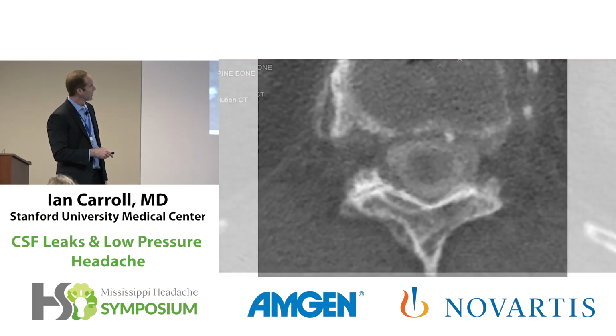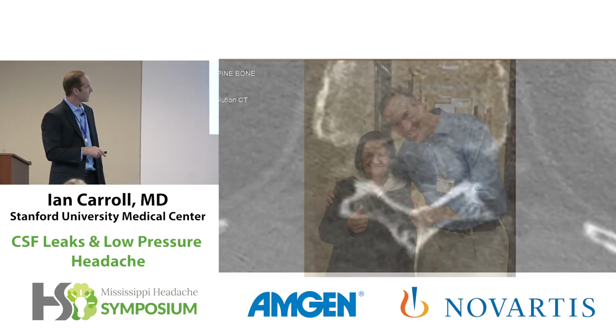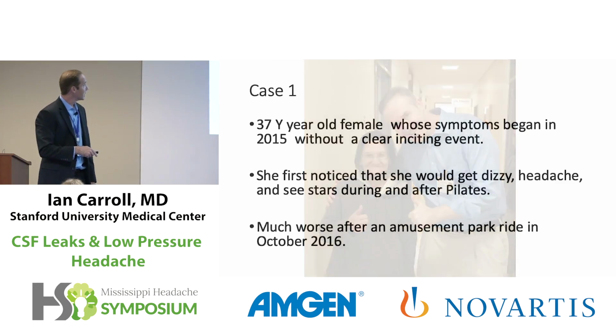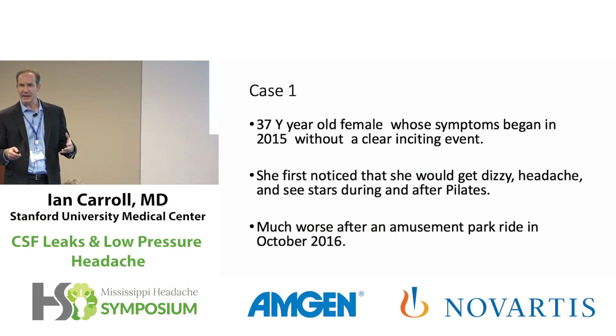In fact, the only thing you see, if you look just a little further away, just up or down at the adjacent segment, is a little kind of puff here and there. And that is it. That's what she looked like after getting patched. And that's the basics. That's a generic CSF leak case. Nobody sees it as controversial, very straightforward.